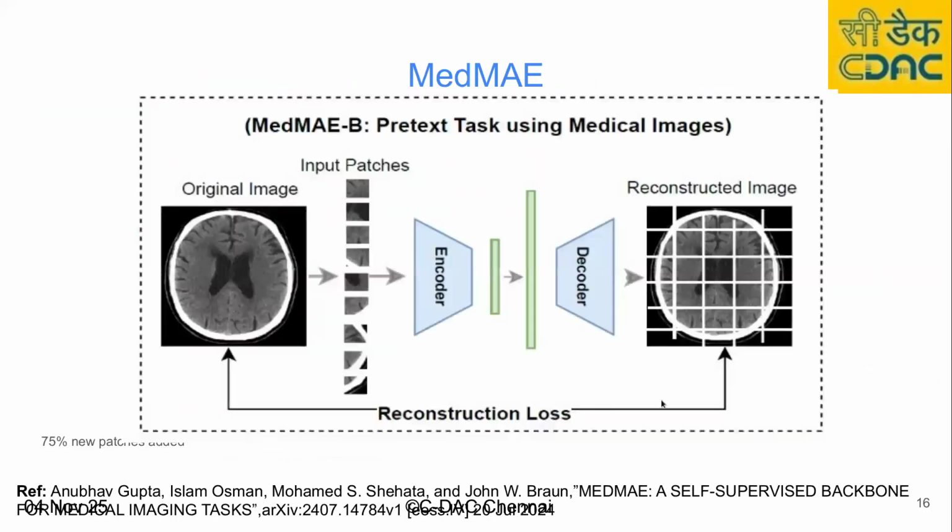And there is something called medical encoding of images. For compression purposes, we can use autoencoders to encode and compress the image, store it as a small size image, and later reconstruct the image using another neural network. These are called encoder decoder autoencoder networks. That is also used for reducing the storage size. These are the different applications we discussed for medical imaging.